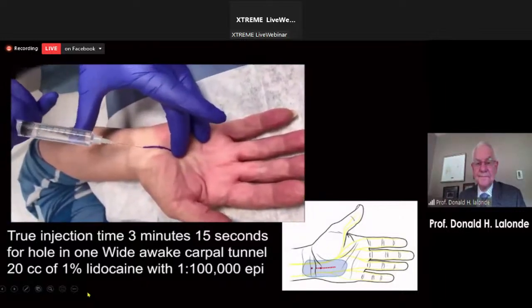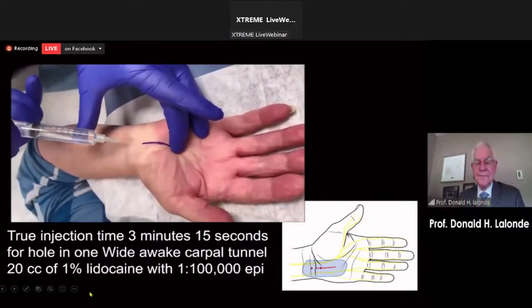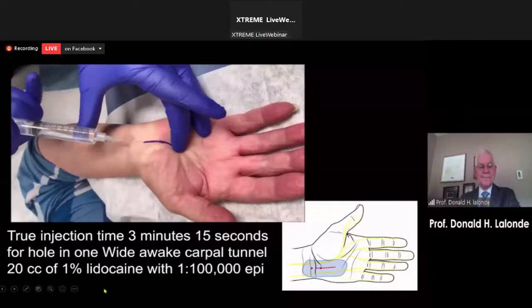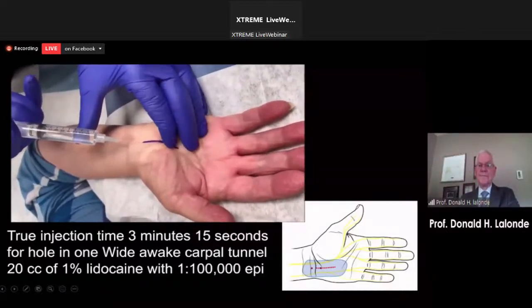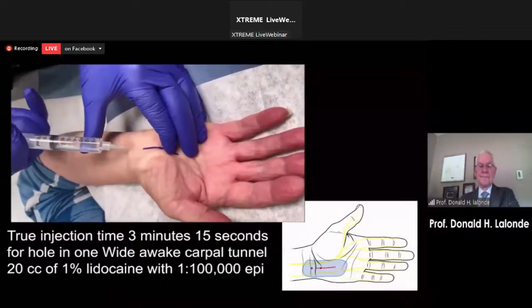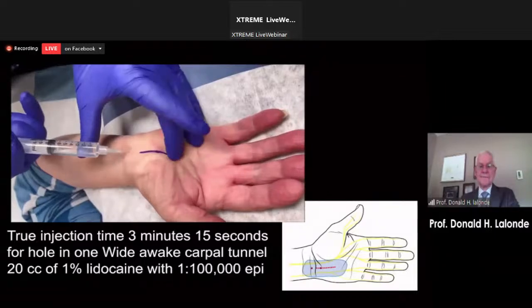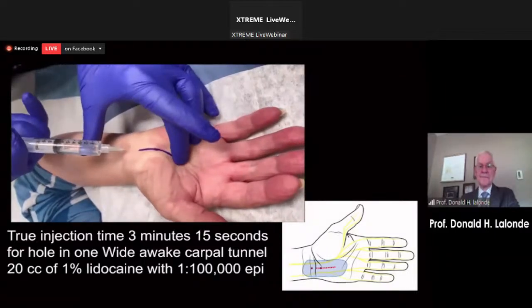That didn't hurt, eh? No, not at all. So far you've just felt the first little poke, right? Right. And since then, no pain? No. Great. So what do you normally take for pain? Advil, Tylenol, nothing? Tylenol, perfect. Well, you know, that's all you're going to need for this. You're not going to need anything stronger than that.